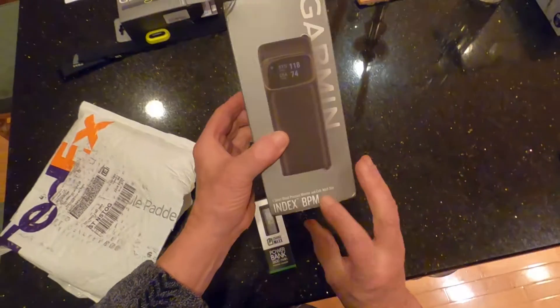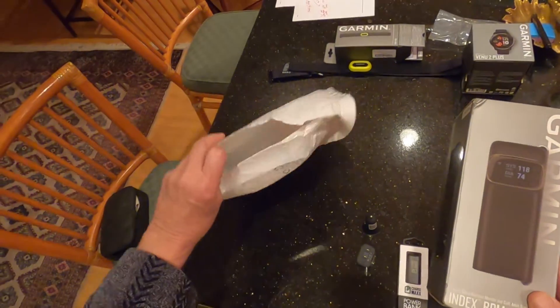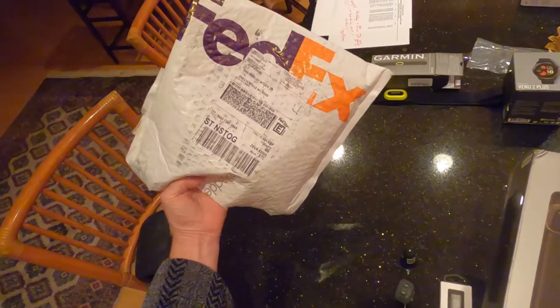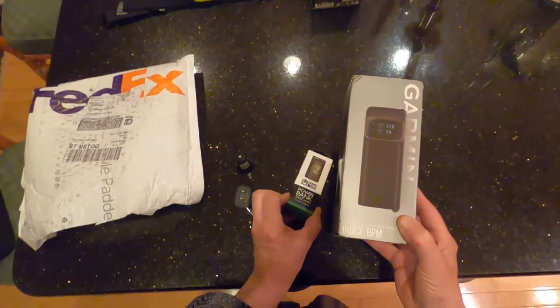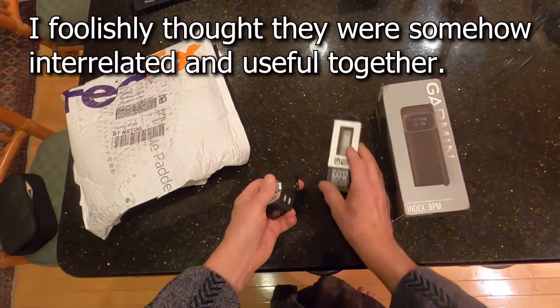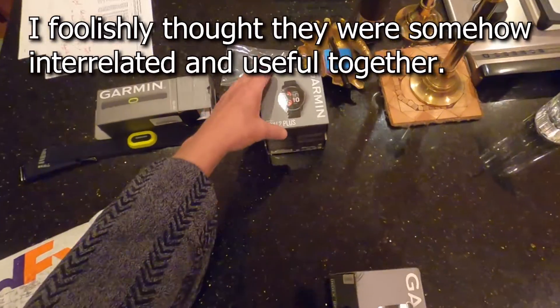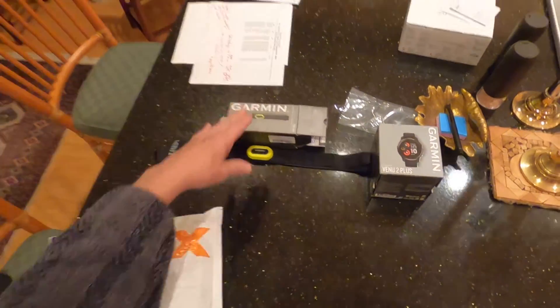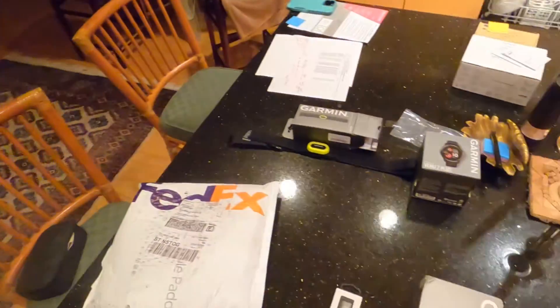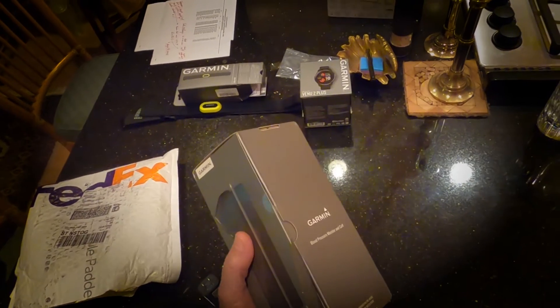Garmin index blood pressure monitor came in this FedEx blister pack. They were just loose laying in here. I have the Garmin watch and this, and my bike over there is rigged up with all kinds of Garmin things, so I've been using Garmin Connect.